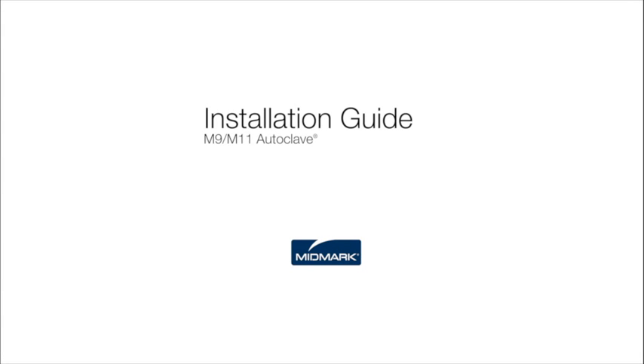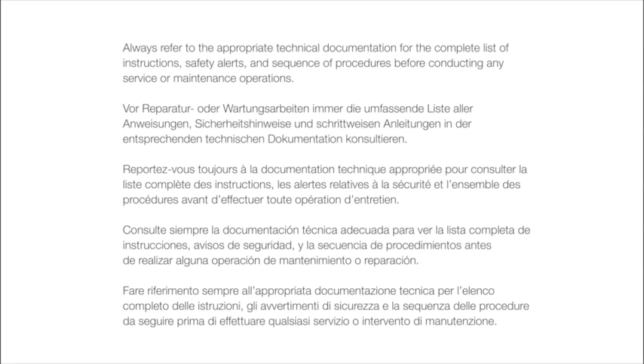This video is an overview of the installation. However, always refer to the appropriate technical documentation for the complete list of instructions, safety alerts, and sequence of procedures before conducting any service or maintenance operations.